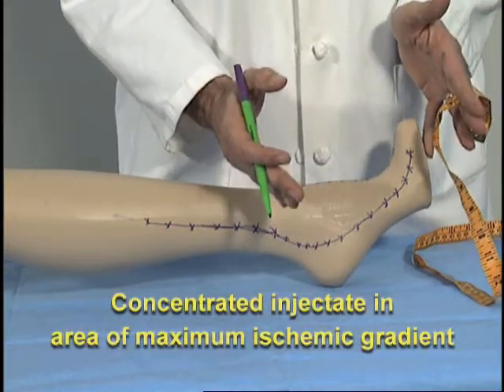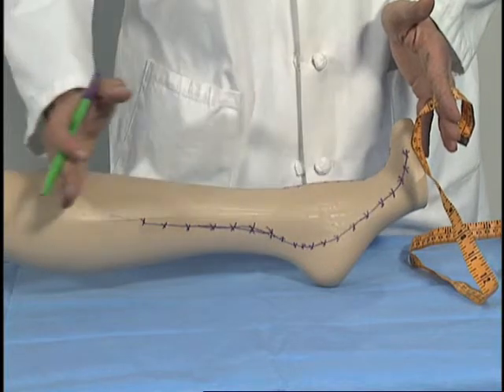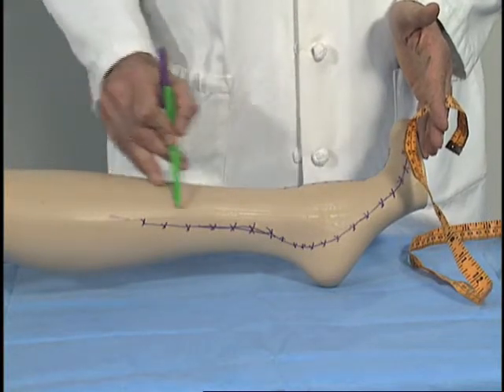and we've concentrated the injectate in the area of the maximum ischemic gradient, in the area where we most would like to see clinical benefit, and then we have distributed the remainder of the injectate where we think there'll be additional benefit in terms of bringing the flow into the field.